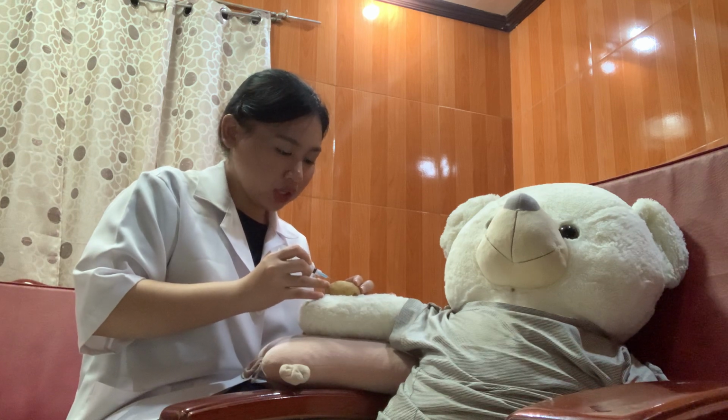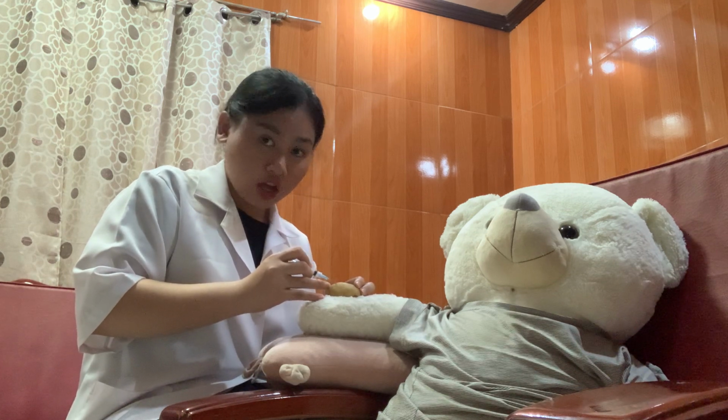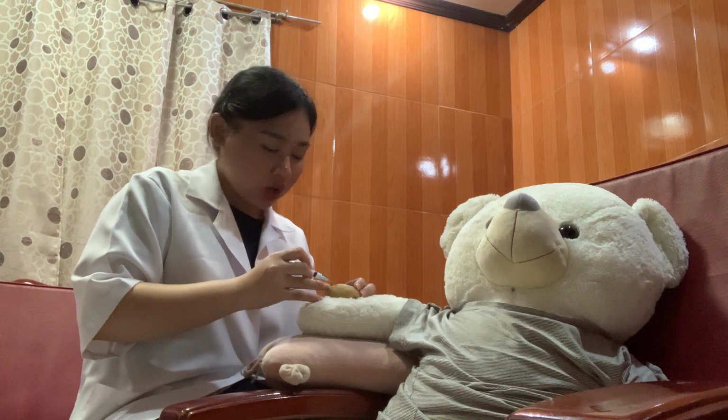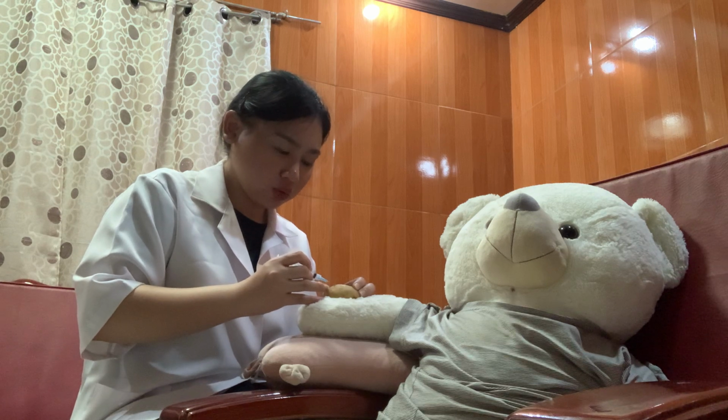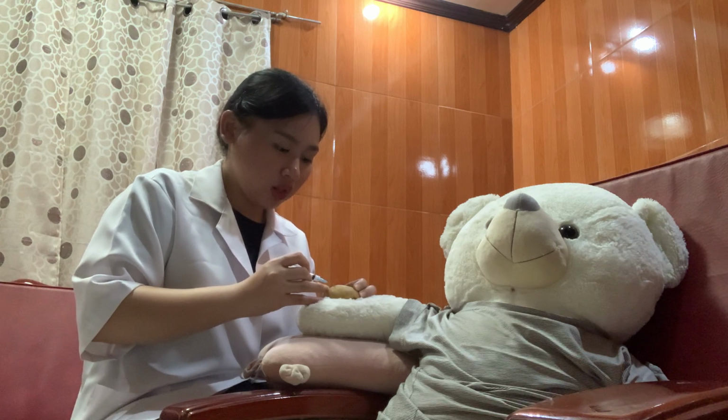After we puncture, we observe for the syringe to have a flashback of blood.